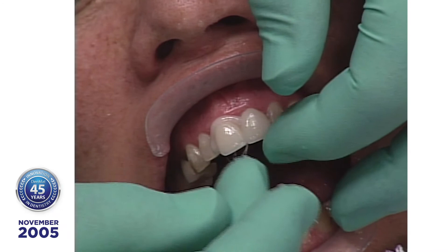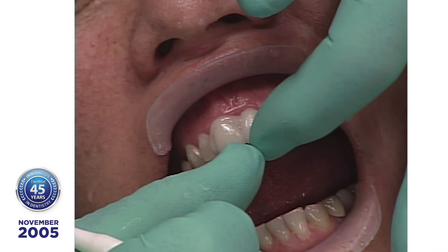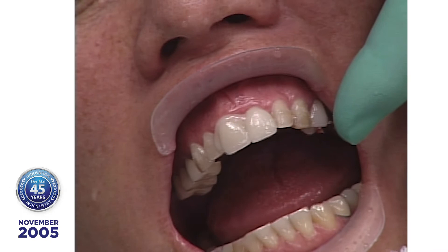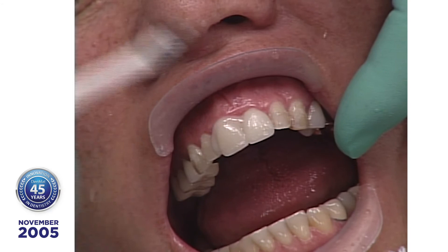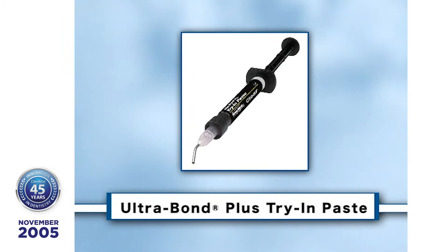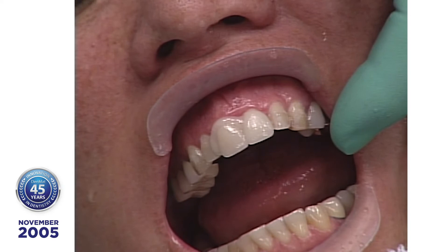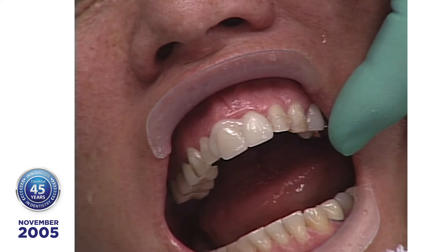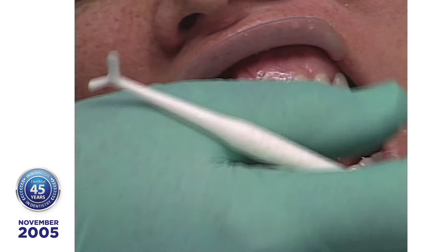Why is the left one whiter? There's a phenomenon in the optical transmission of light — when it goes from one medium to another, if it doesn't exceed what they call the critical angle, the light transmission continues on. By putting the ultra-bond try-in paste on the right central, we're picking up a little bit from the natural tooth. On the left side, we're not picking up anything because the critical angle was exceeded when it reached air. So that looks whiter — that's why you get that frosty white look.